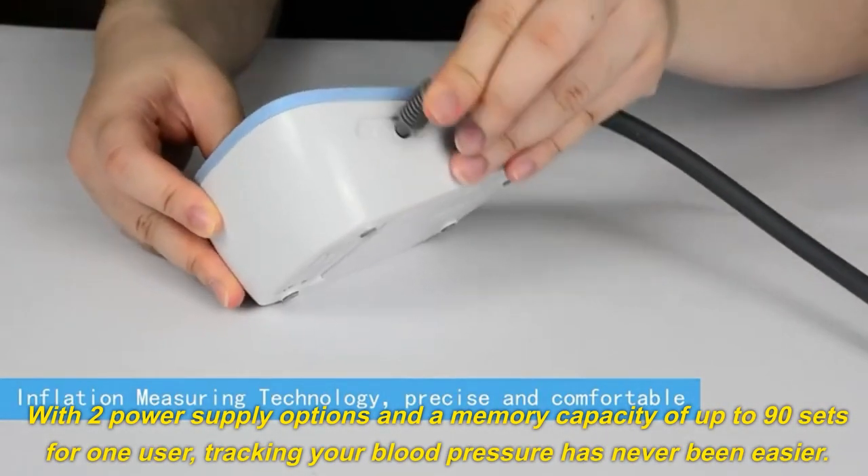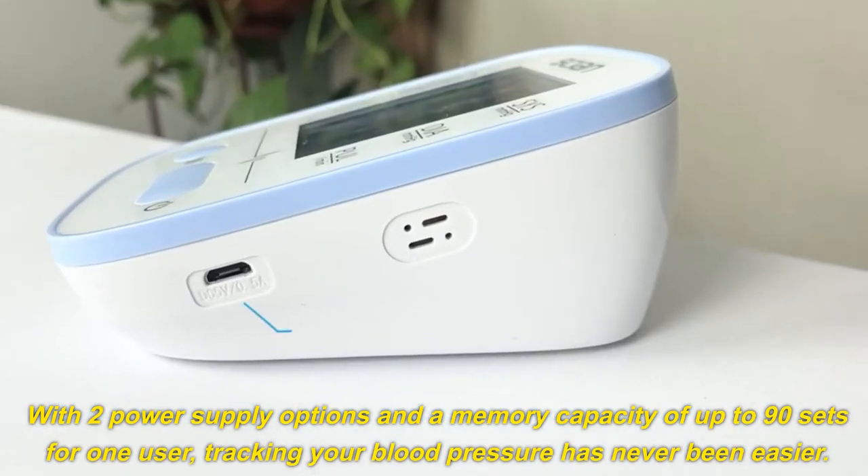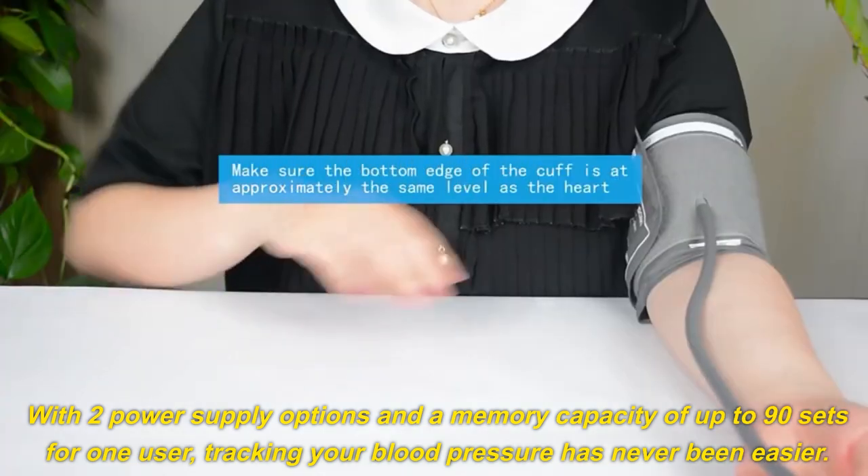With two power supply options and a memory capacity of up to 90 sets for one user, tracking your blood pressure has never been easier.